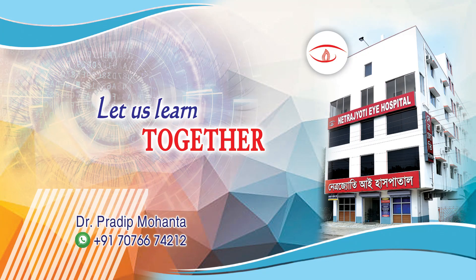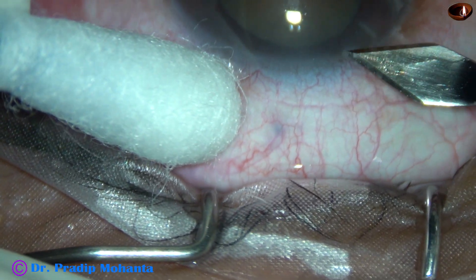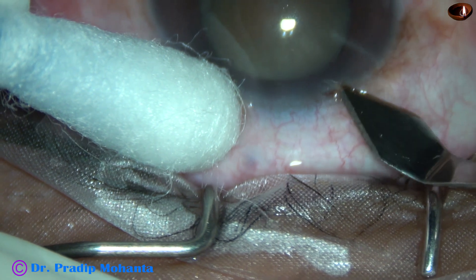Friends, welcome to my workplace at Ranagahat, West Bengal, India. Intraoperative miosis occurred in this case. Let us observe this surgery.